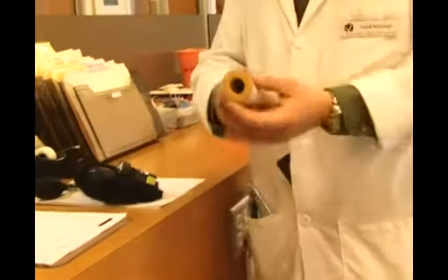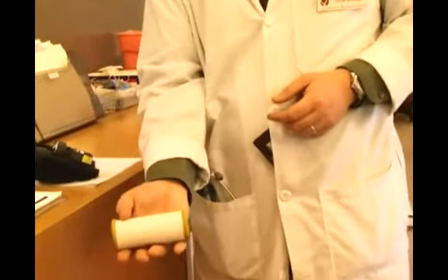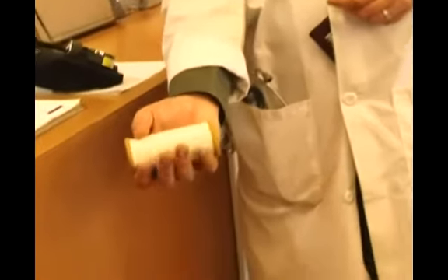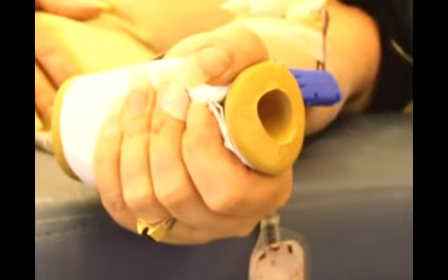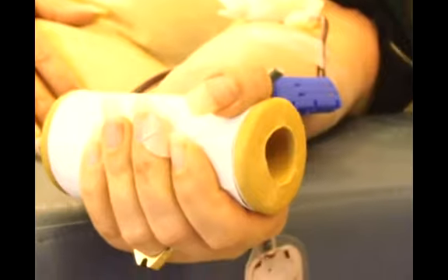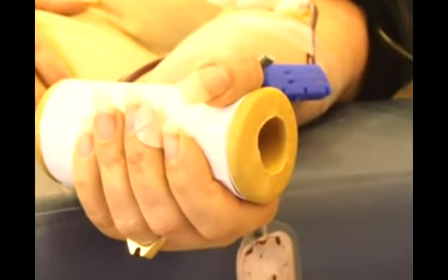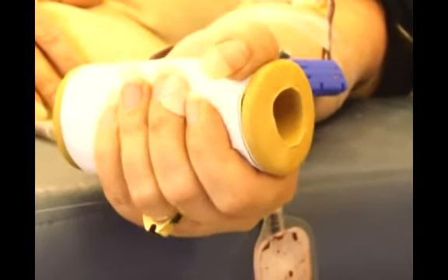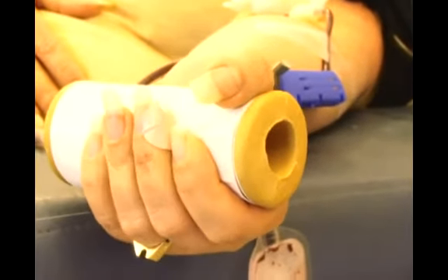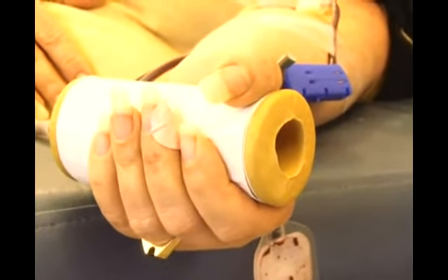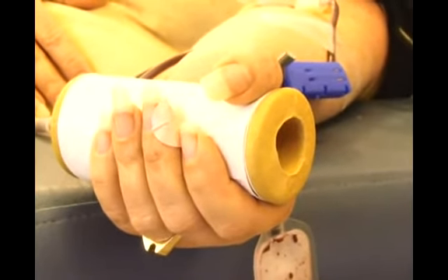And then we're going to have you hold this hand gripper. During the donation, it's good to squeeze it every three to five seconds or so, or do a continuous roll. This makes sure that your blood stays steady and that you'll finish in the time limit, which is 15 minutes. If you keep a nice rolling and squeezing motion, you shouldn't have any problem with finishing.